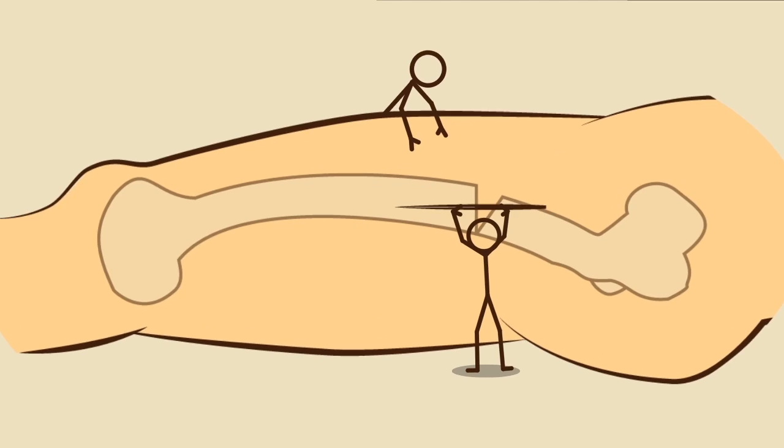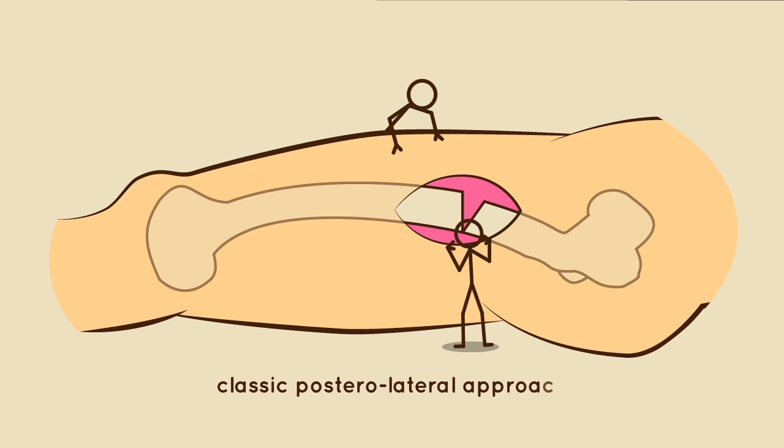Open osteotomy technique. Through a classic posterolateral approach, the femur is exposed subperiosteally. Subsequently, the first osteotomy is executed under C-arm guidance.